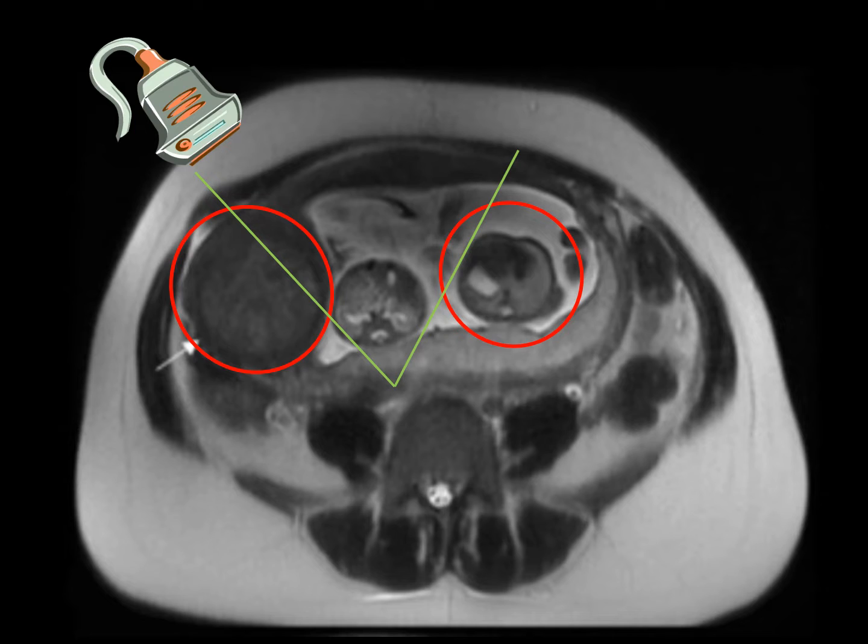And so while you can image through fibroids, large fibroids, they do create some attenuation of the ultrasound, and quality of imaging is not as crisp.